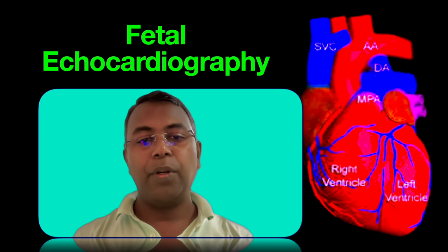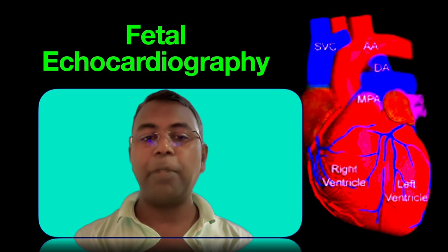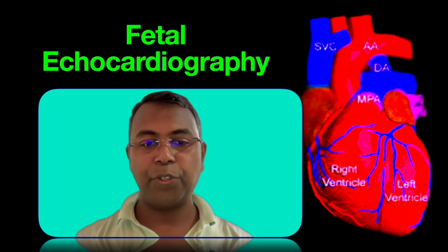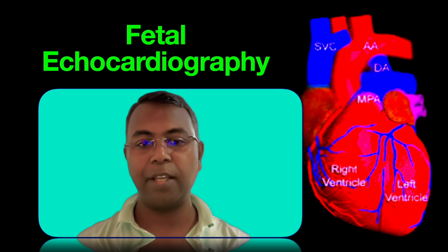So we always start fetal echocardiography by establishing a situs. There are different ways and means of establishing the situs. What I follow is that I align myself along the lie of the fetus and see whether my situs and the baby's situs are similar or not.